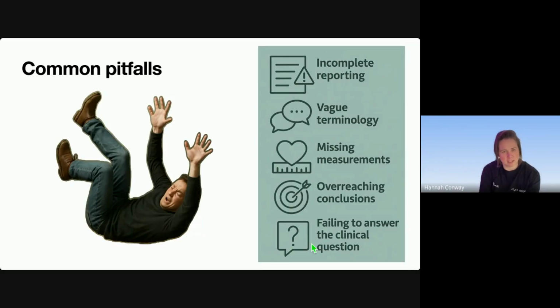And then I suppose the last thing is you must be able to answer the clinical question. So the first thing is there must be a clinical question. You can't just say, oh, this is a training scan. There always has to be a reason why you're doing it. And certainly when you're doing it outside of your accreditation, you have to rationalize and justify why you're doing a TOE. It can't just be as simple as LVRV function assessment, because arguably you could do that with transthoracic. So why have you chosen to do a TOE on this patient? Okay, and that will then lay the foundation for your report, because everything you're doing is to answer that question, and that's what we want to see on your reports when we're examining them.